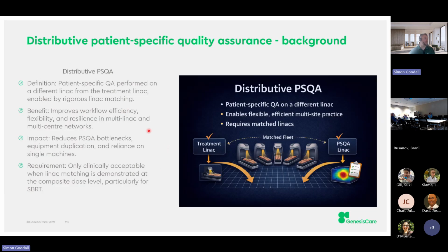But we know when we get to this level of complication, small linac calibration issues can cause quite big dose differences in delivery. What we wanted to know is if we could use different machines to treat the patient. So if we could have different fractions across different machines, and if we did that, do we need to measure the plan on every single machine, or can the measurement on one machine be representative of the dose delivered on another? And it provides us a lot of benefits.